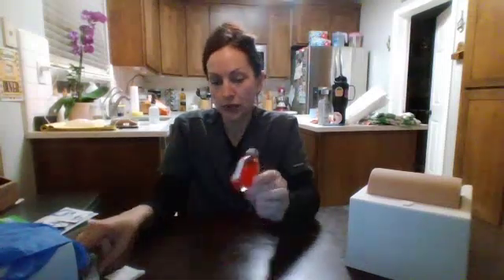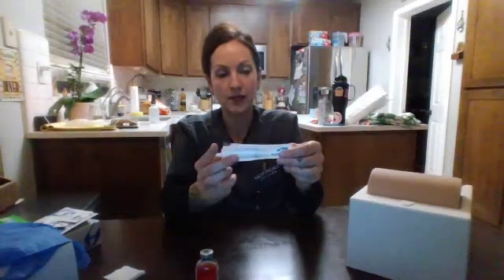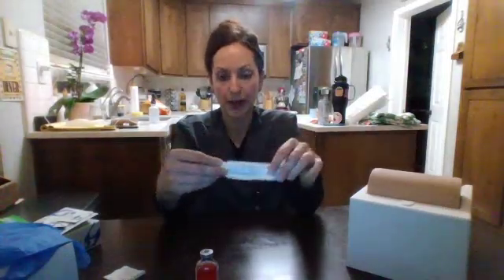My supplies include the medication and the 3 ml syringe. It could either be a 1 ml or a 3 ml. I have a 3 ml syringe. I have a 25 gauge 1-inch needle. I don't have a 25 gauge 3/8 inch or 5/8 inch needle, so I'm going to just be using what I have. I have a gauze pad, alcohol prep pads, and then my gloves. So I'm going to check and verify the physician's orders, gather my supplies.